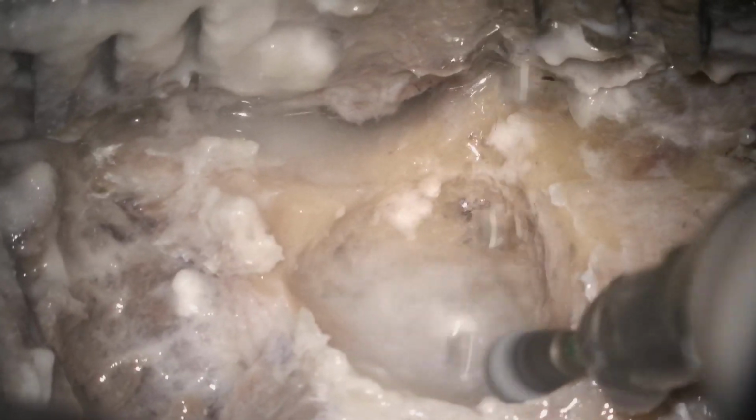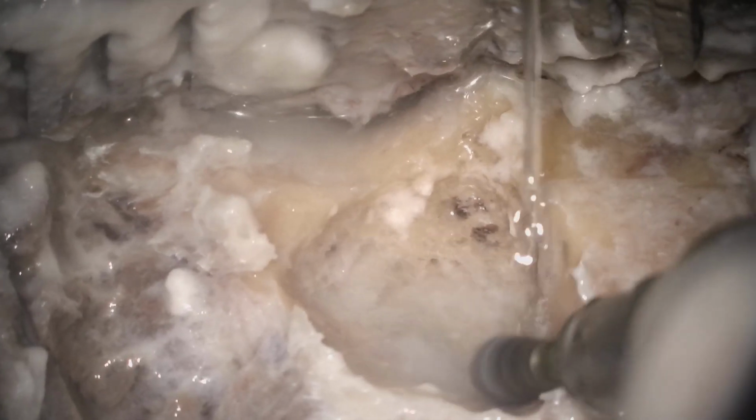If you use your bur in a faulty direction, then it can cause damage very easily. Every time the bur is visible, the total bur is visible, yes, always, because it has a 360 rotation.